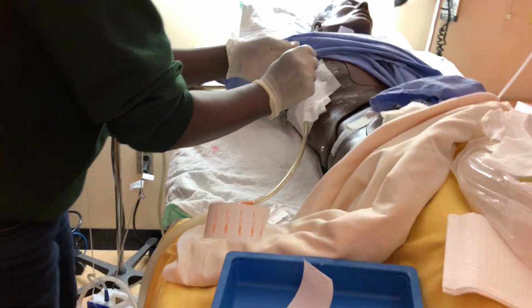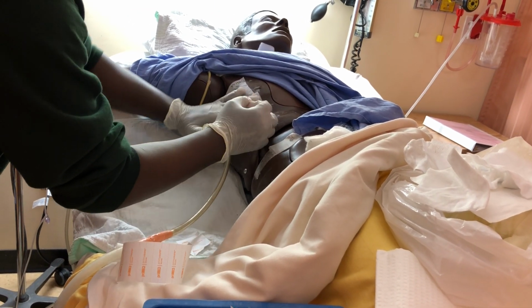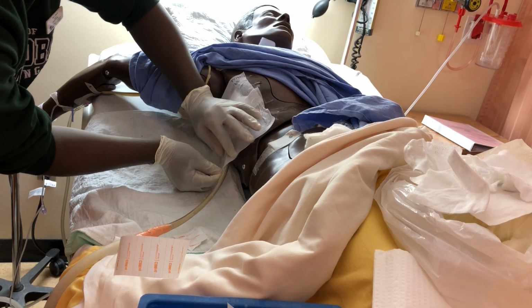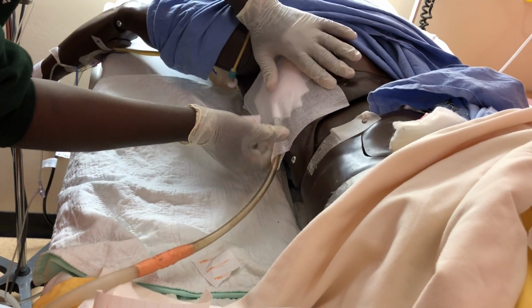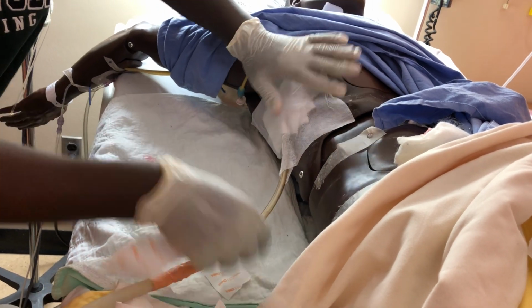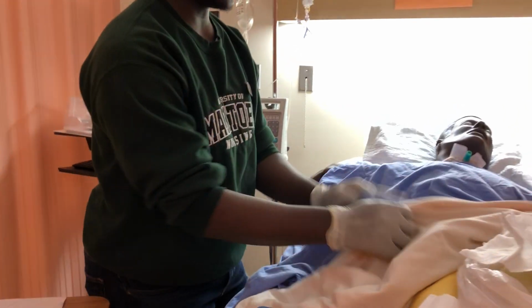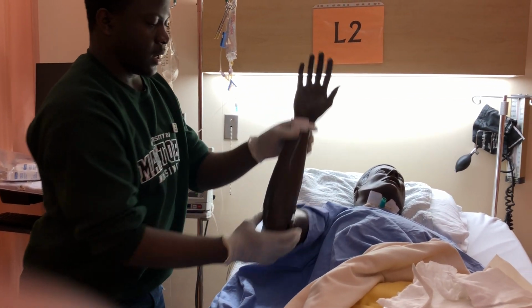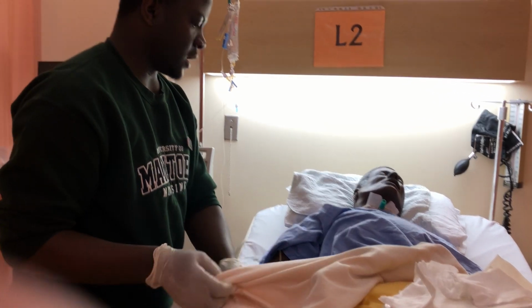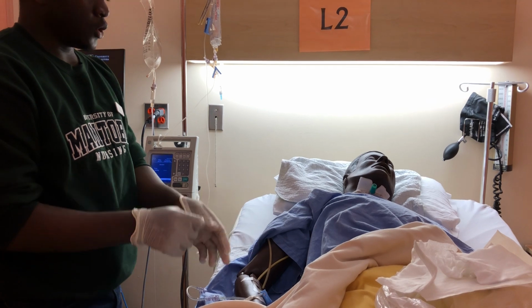Amino acids, 100 grams, dextrose 200 grams, lipid 50 grams. The rate is correct, the pumps are correct. And I've been making sure at this point to tape this down so that if the patient pulls on it, it's not going to harm him. Okay. And then I can just cover the patient's dressing and put his arm back. And I will inform him to let me know if he feels any discomfort or anything unusual.